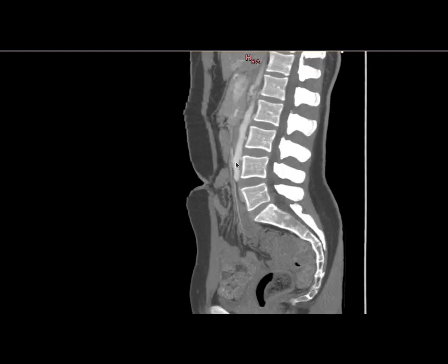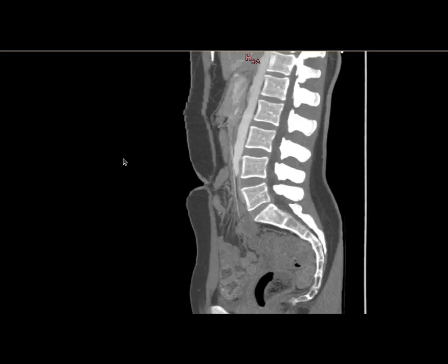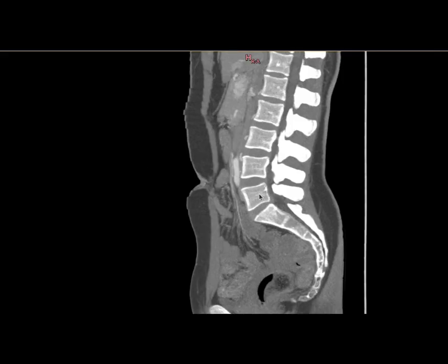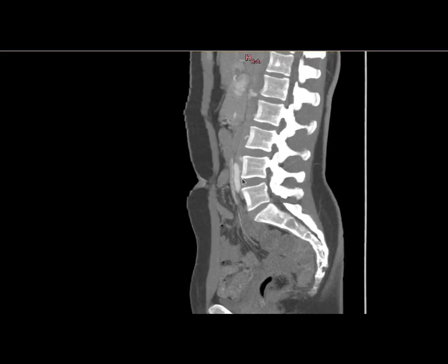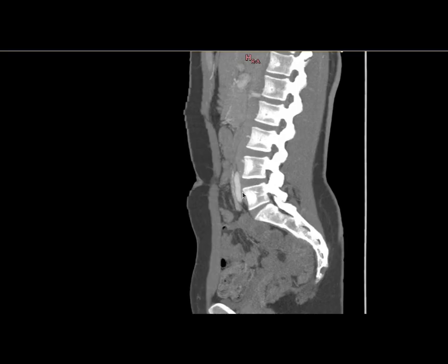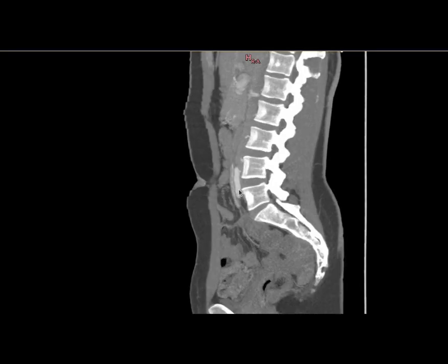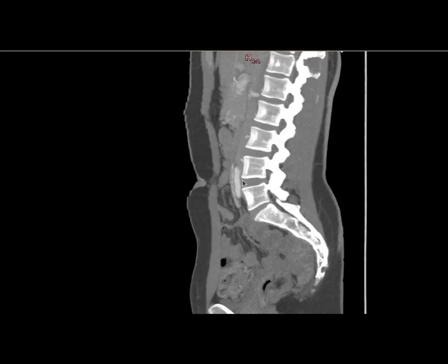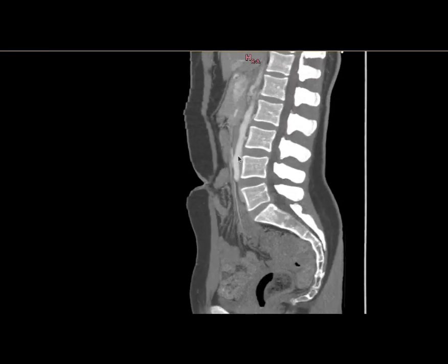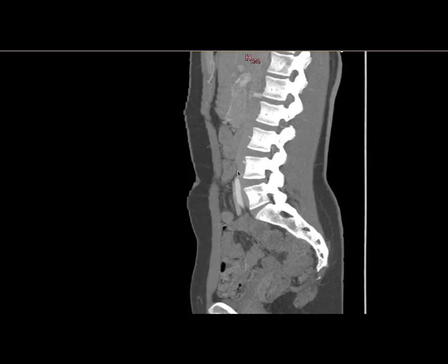Following the right common iliac artery down, you've got your L5 and L4 vertebra, and your vein is passing down in here. See how this artery passes very close to the vertebra? Your IVC and left common iliac vein — you can kind of see the compression in this view.